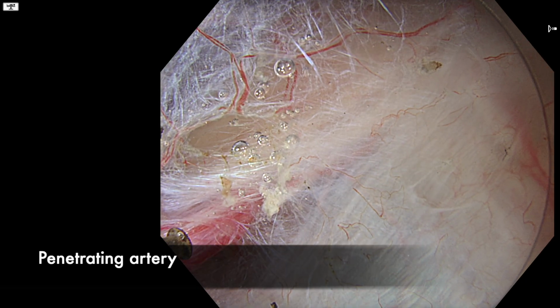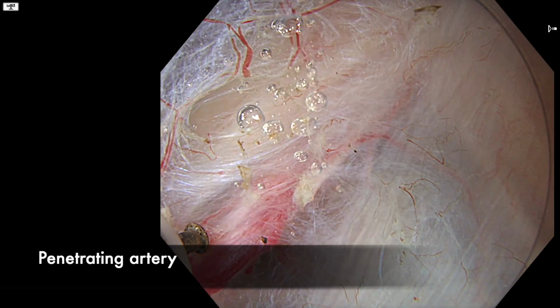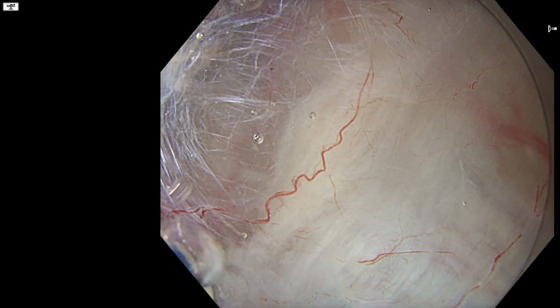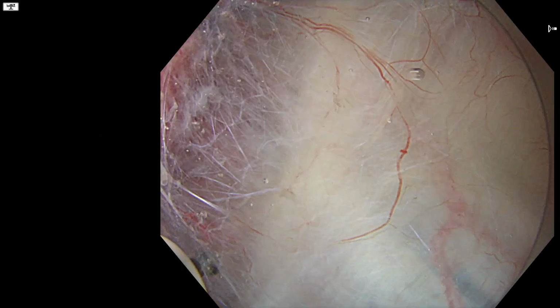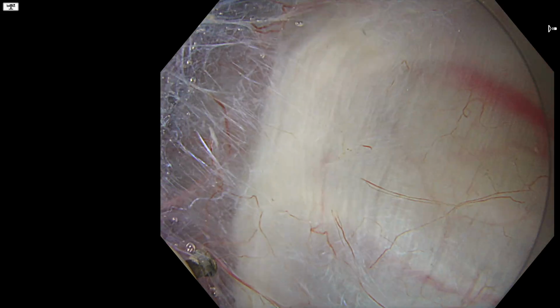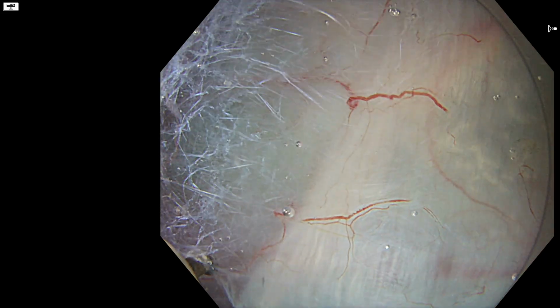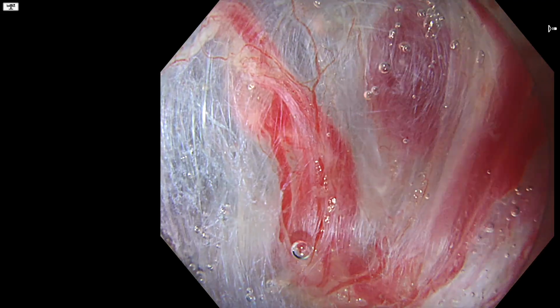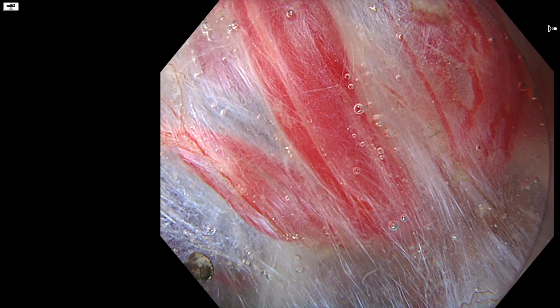We can already see the first penetrating arteries here, which are pulsating. So I'm working my way around them slowly, trying to isolate them and trying to get a sense of how many of these vessels I see, so as to decide whether or not I'll need the coag grasper.